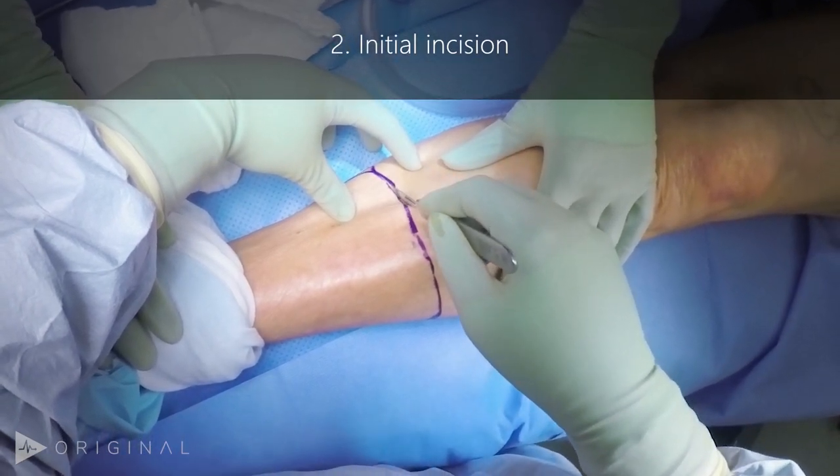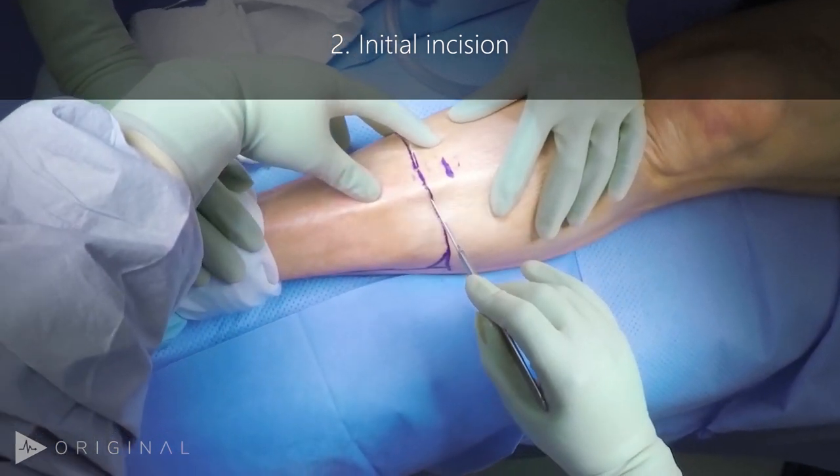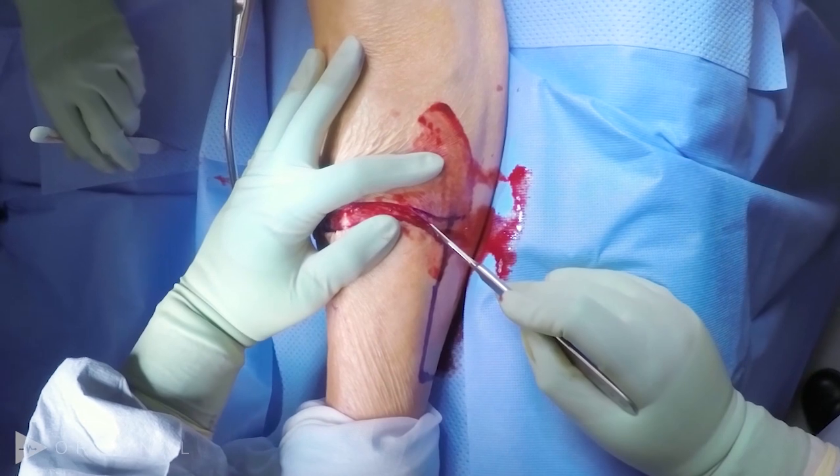The incision is made through the skin and subcutaneous tissue. Although it's not shown here, we make sure to clamp and tie the superficial veins that are cut in this maneuver.